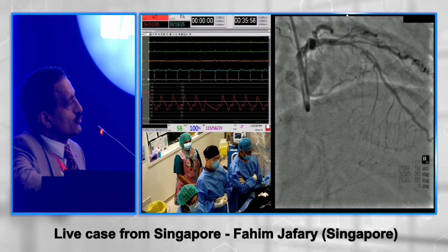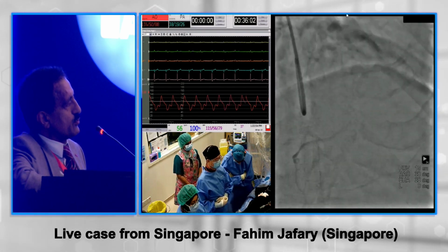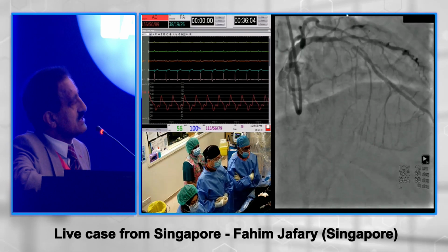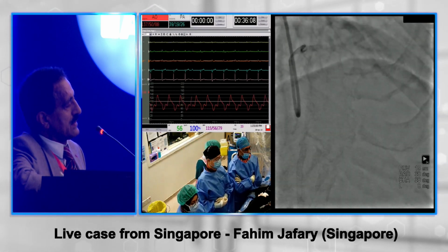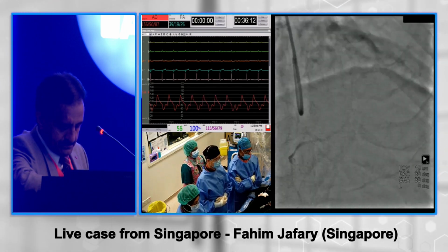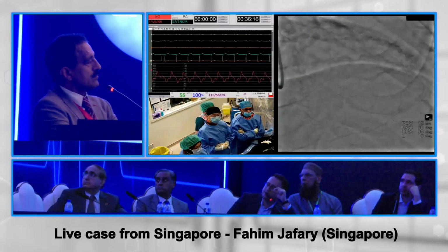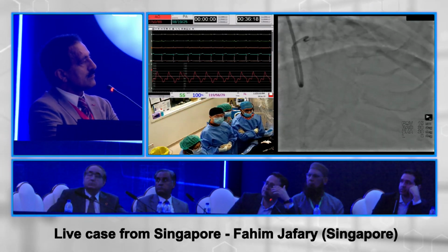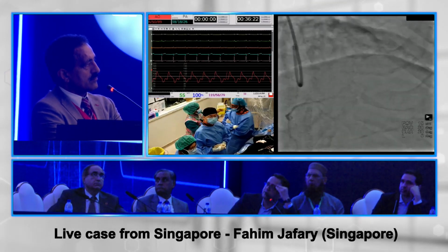So Asad, there are two questions to you. One, would you consider any hemodynamic support before starting this case? And second, how would you deal with it? Yep. So great, very complex case, especially the fact that the left side is supplying the right coronary artery as well. Imaging upfront for sure. Question regarding atherectomy, I don't think there is a question of that. You cannot do this case without atherectomy. You'll have to do it.